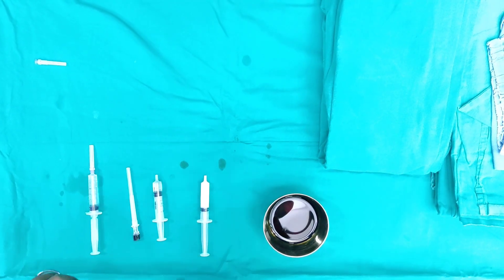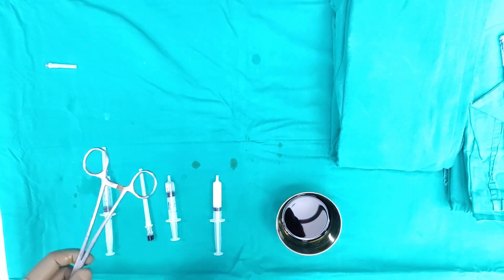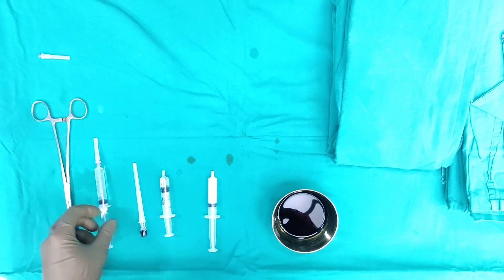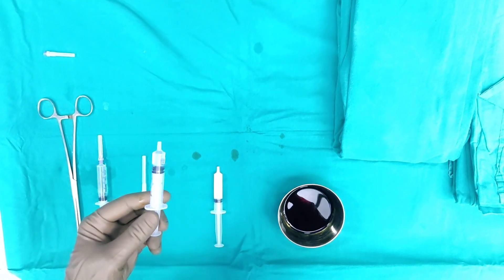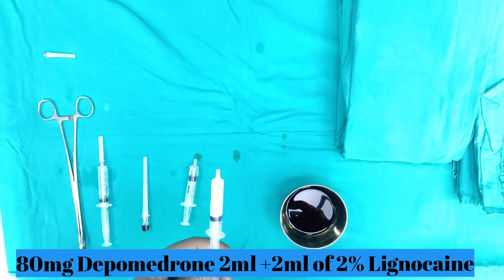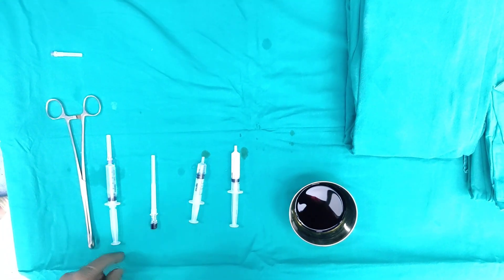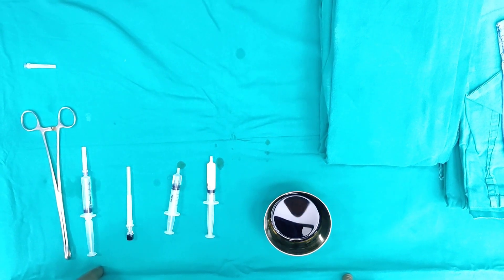We need a sponge holder first to clean and to localize the inferior aspect of the sacroiliac joint. We have one to two percent lignocaine, five mils, to anesthetize the area. We have a 22 gauge spinal needle, Omnipaque dye to localize the correct position, and a 4 ml mixture of 80 mg Depomedrone which is 2 ml, and 2 ml of one to two percent lignocaine.